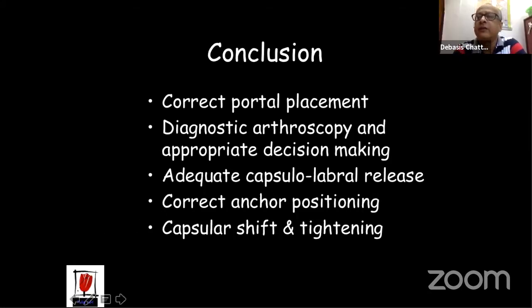So in conclusion, the final thing is the correct portal placement, which is important. Otherwise, you will struggle to do the job. Then appropriate diagnostic arthroscopy and decision-making is important because not every case may be managed by Bankart repair. So your diagnostic arthroscopy and findings and their analysis gives you the correct decision. Adequate capsulolabral release is very, very important. That will give you a very good, proper marginal repair.